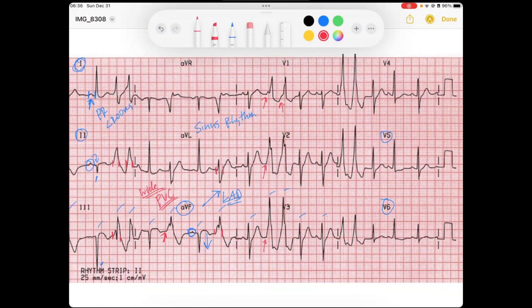In the form seen here, this would be a couplet — any two PVCs in a row is a couplet.